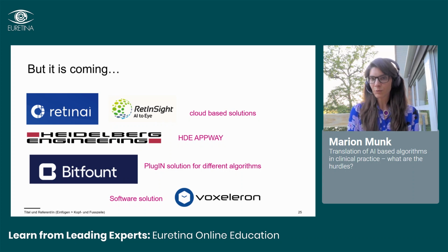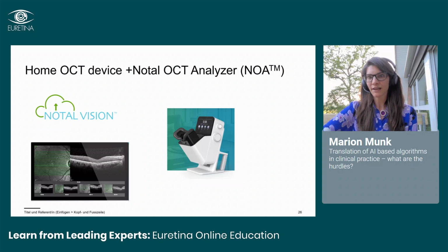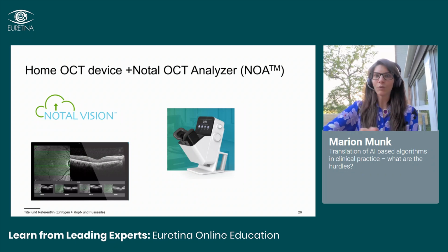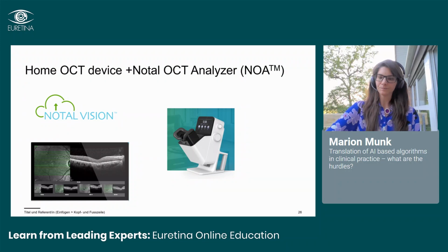There are several cloud-based solutions, also plugins if you do not want to upload your images to the cloud. Heidelberg also has a very interesting offer where they offer different AI-based algorithms on their platform, and you can just upload the images. One interesting example is also Notal Vision, and of course Anat was very much involved in the development of this device and algorithm, which is an inbuilt home office OCT, and this is currently also tested in a prospective trial which was initiated by Bayer.